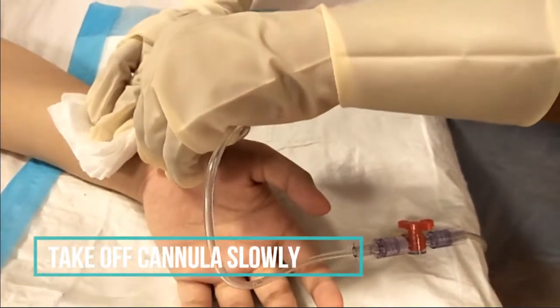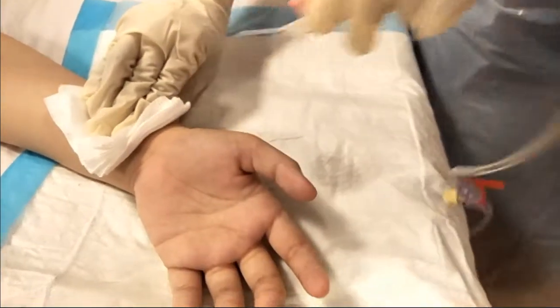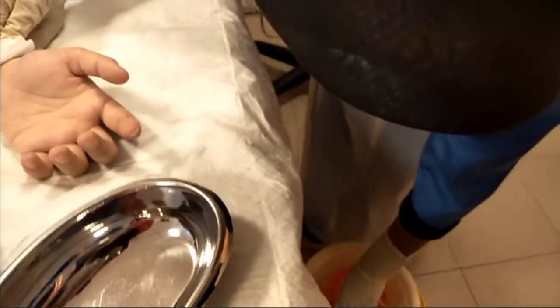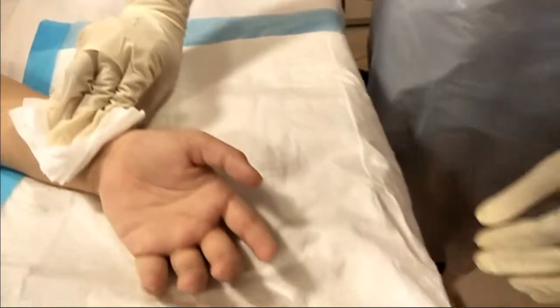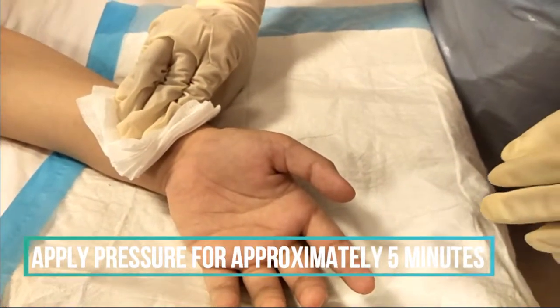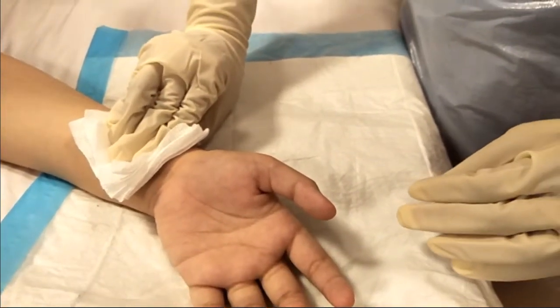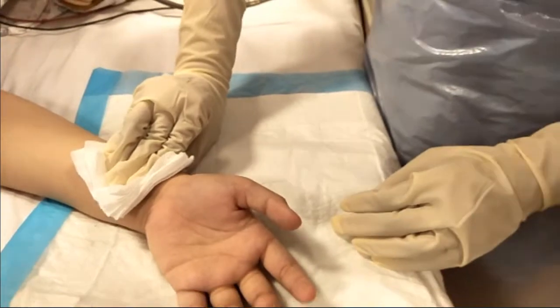Slowly take off the arterial cannula while putting pressure on the gauze to reduce blood flow. Maintain the pressure on the gauze approximately 5 minutes to ensure the blood does not flow out and to ensure enough time for the bleeding to stop.